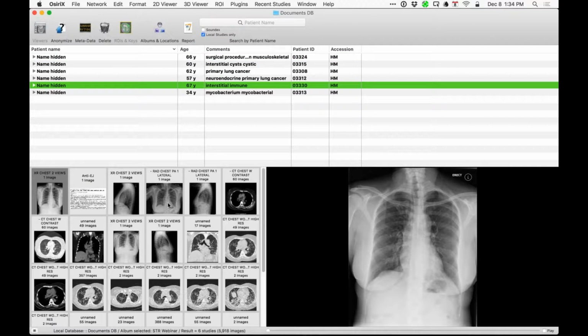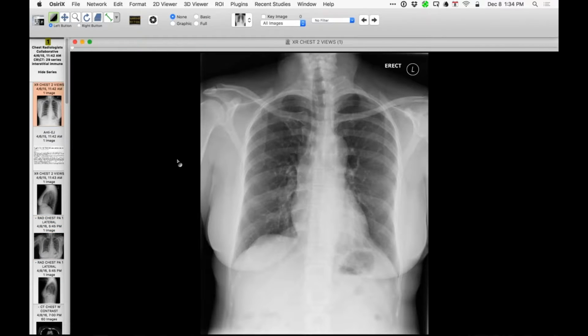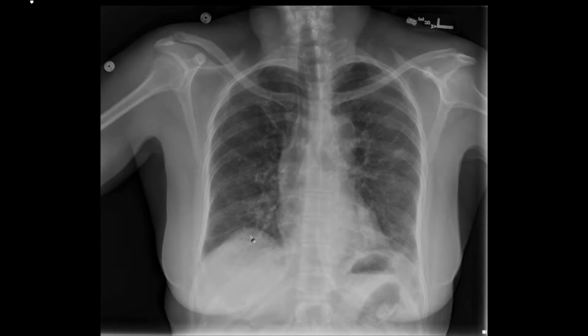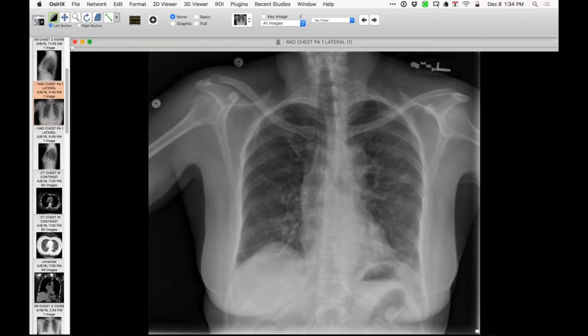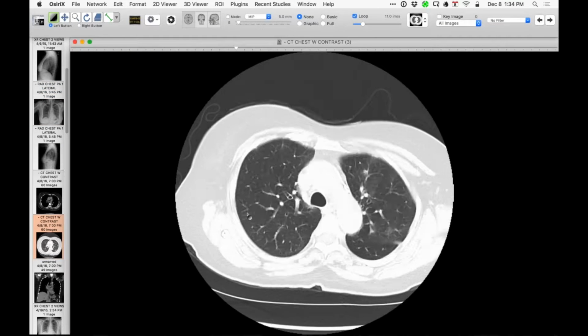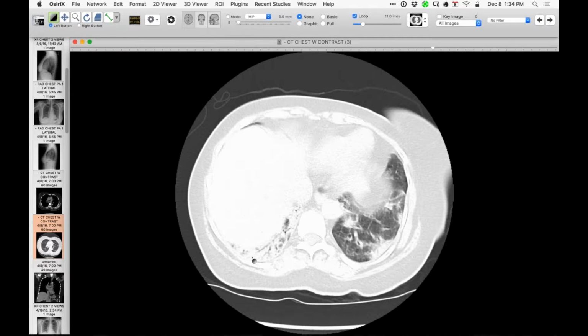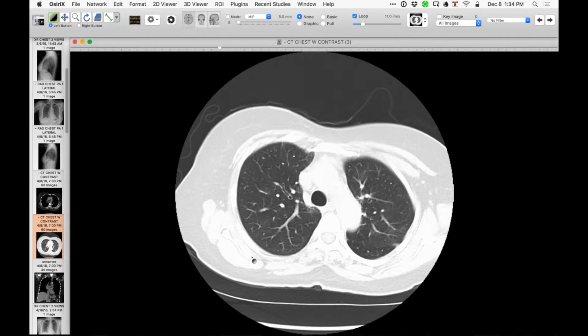This is a nice example of a patient that developed, as best we can tell, a cough. She just wasn't very well. I think a cough and maybe some dyspnea were part of her presentation. This is a radiograph from April of 15. This is one now. The difference is that she's got some ill-defined, poorly marginated, non-segmental, patchy opacities in both lungs, and inflation of her lungs is a little diminished from the comparison exam. This is what the opacities look like on 5mm cuts. There are multiple patchy, multilobar ground glass opacities, mostly with some consolidation, in her lower lung zones. The thin cuts pretty much show the same thing.